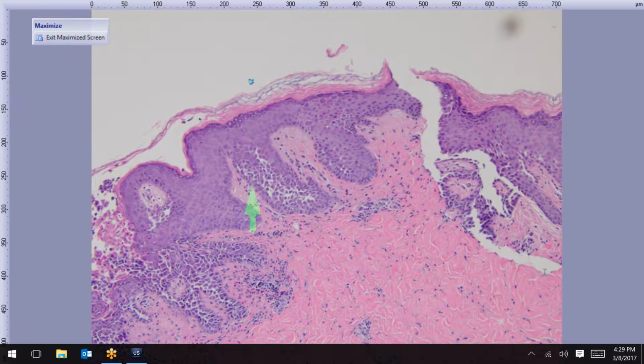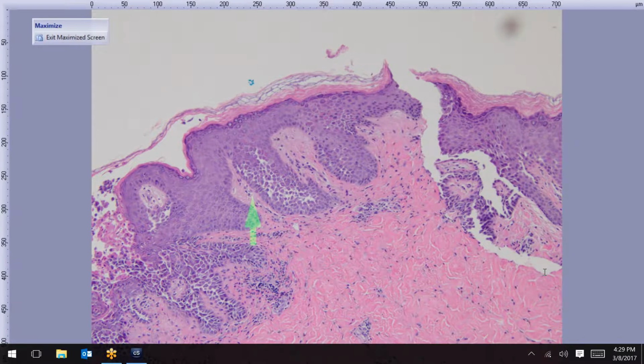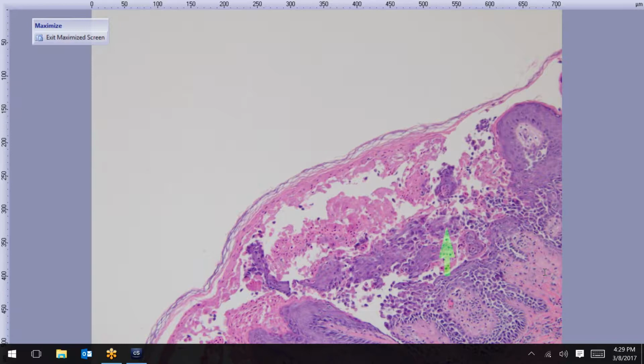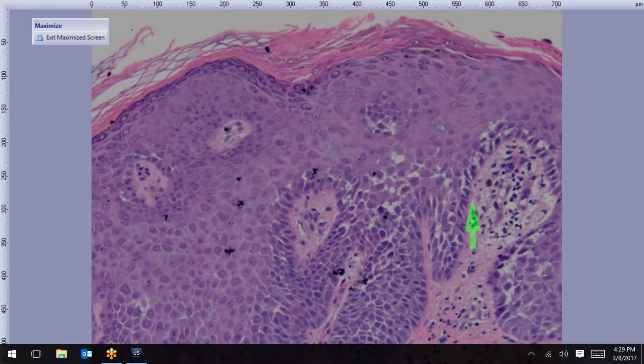So you have this full thickness acantholysis, which is often referred to as a dilapidated brick wall. And I think there is some dyskeratosis here, but it's just secondary in this case, so I'd ignore that component. But you can see this acantholysis spanning the thickness of the epidermis.